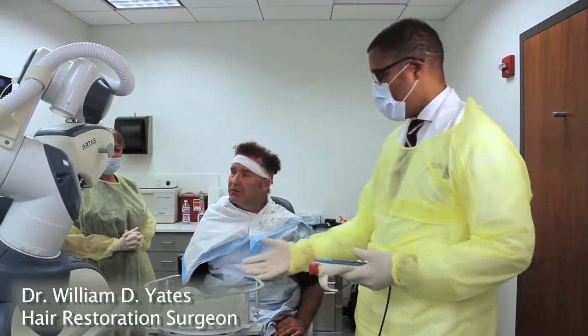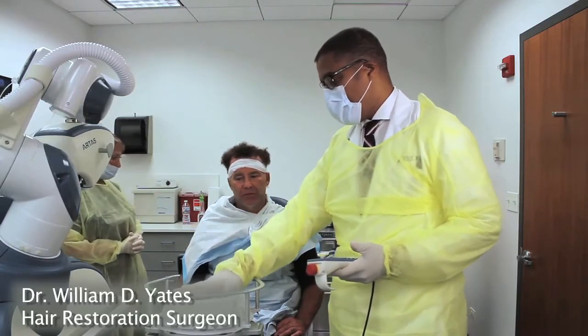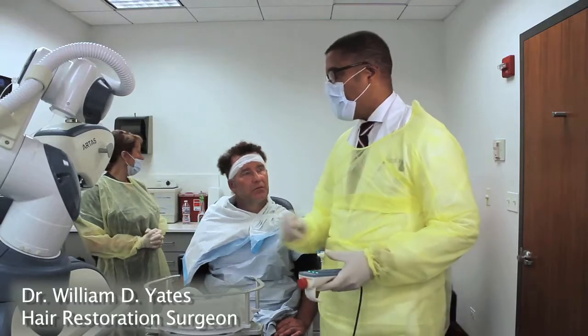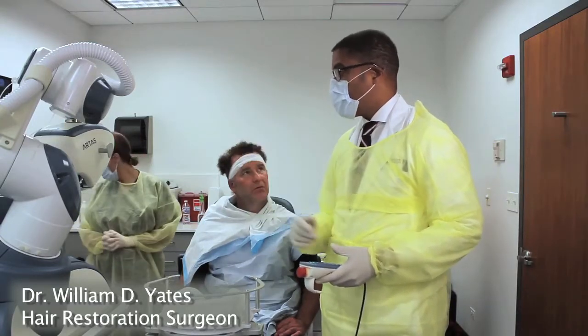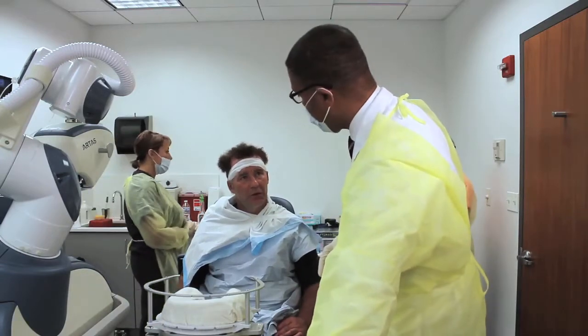This is the artist's computer. This is, of course, the seat. We've already gone through it, but all you'll do is rest your head in here, and it takes about 10 minutes to go through each grid. We'll go through a grid, we'll make sure the graphs look good, and then we'll take it from there and just kind of repeat the cycle all day.